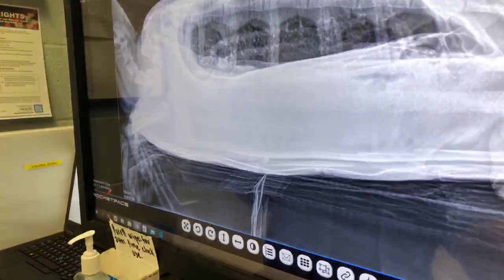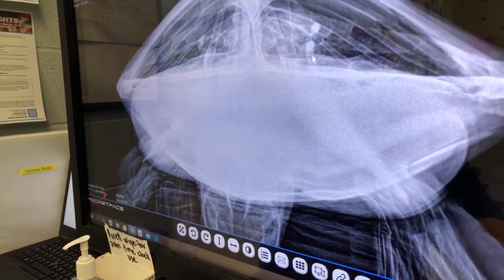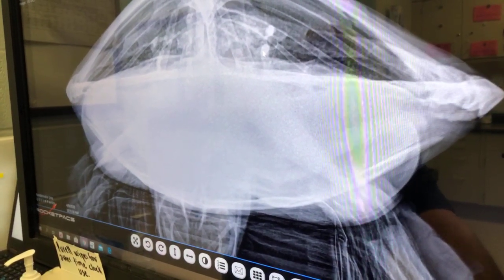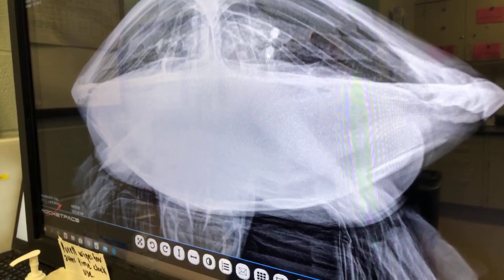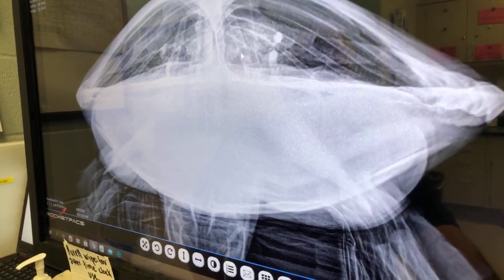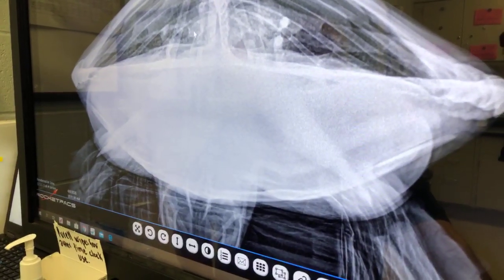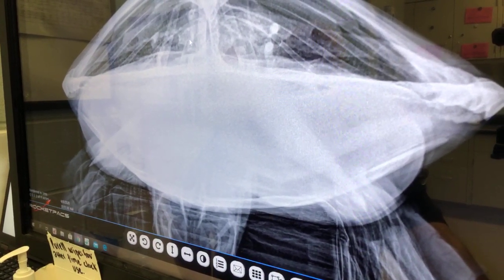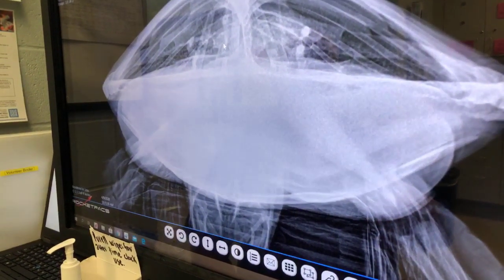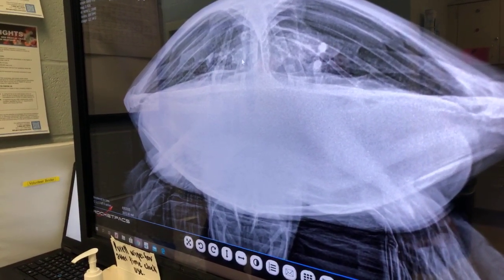Now we're going to go to the head-on view, and this is a little tough, especially on larger turtles, but right here what we have are what we call end-on blood vessels. We are looking at veins and arteries that go into the lungs. But we also have sort of a cloudy nebula looking thing here and here. And then there's sort of a very pale darkening there. This tells me that we're not done with treatment yet. This turtle still has some consolidation in the lungs and we need to continue. Now, fungal infections in sea turtles can take months of medication to treat.